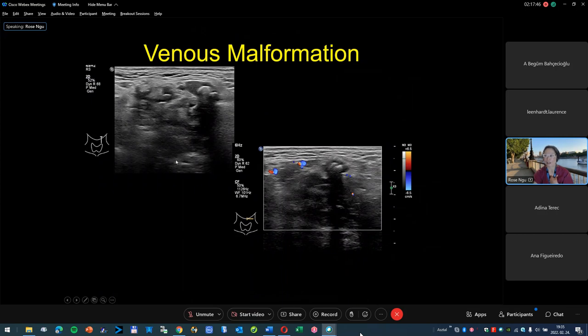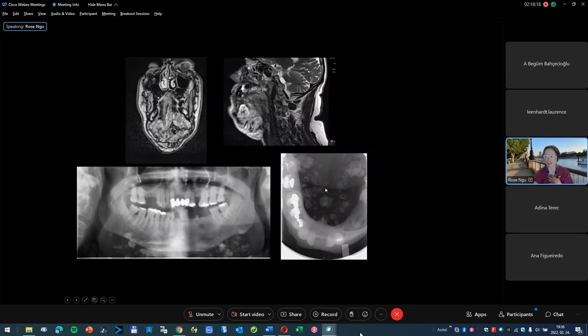Right. This is a case of a patient I saw today. He presented with, you could not see any normal structure of the neck at all. It's all heterogeneous, and you see loads of calcification, and you think, oh, is this a salivary stone in the submandibular gland? But where is the gland? There is no gland. It's completely heterogeneous, with abnormal-looking vascularity.